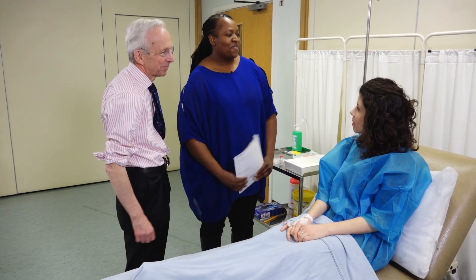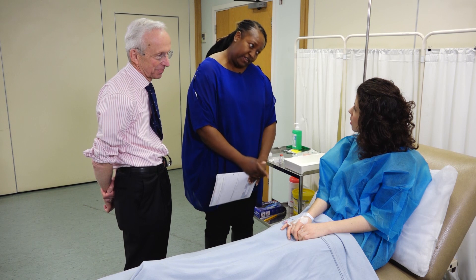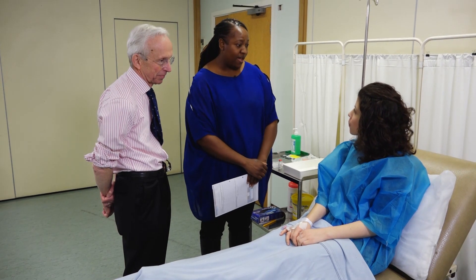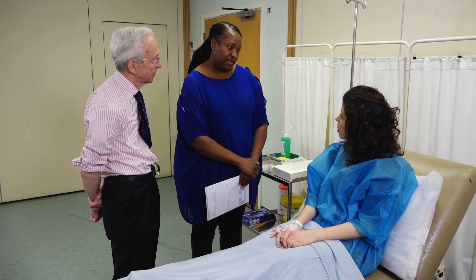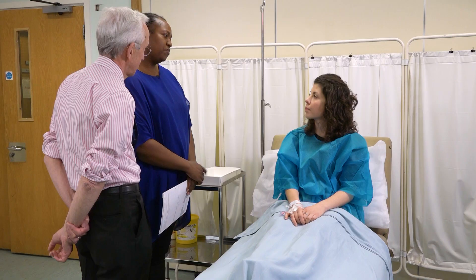Welcome to this video which demonstrates how to reconstitute an intravenous antibiotic and administer it via an intravenous infusion.